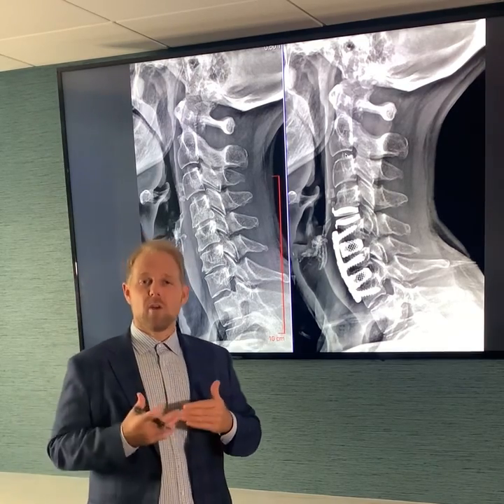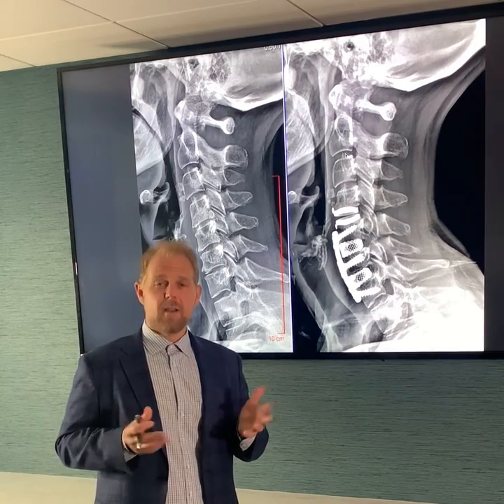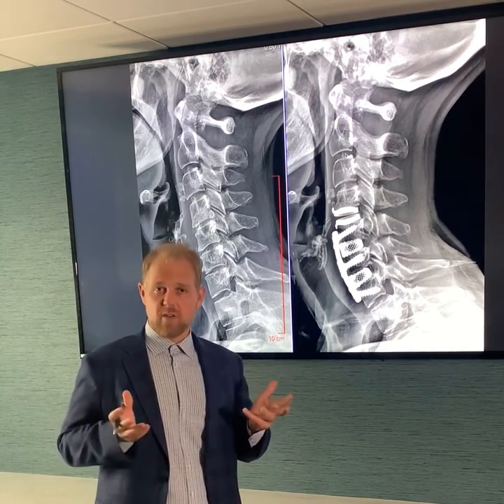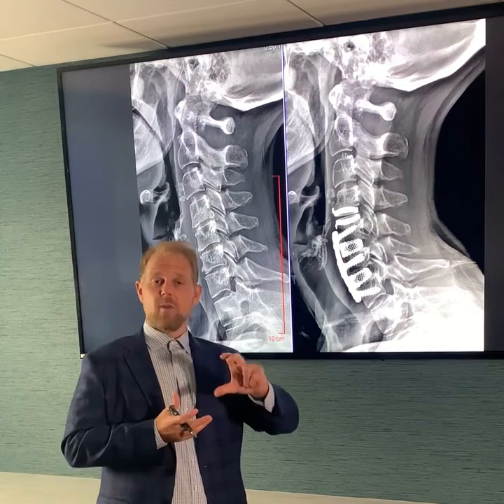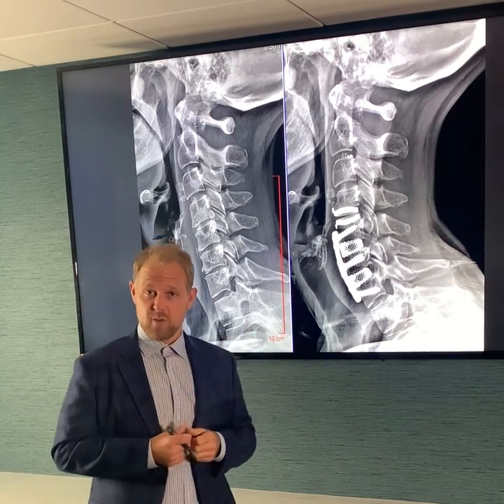I believe this is a much better option than just going ahead and fusing all three discs. That was more of the old school treatment — the cookie cutter approach of just fusing every disc that's gone bad. But we know if you fuse three discs you give away more motion of the spine, and now there's a lot of stress on the next disc, which may go on to require a fourth level of fusion down the road.